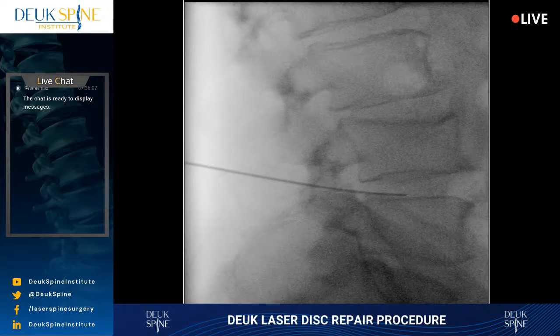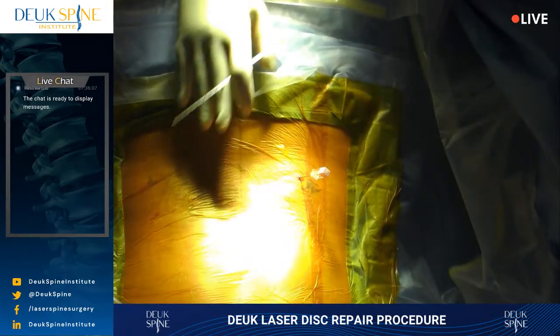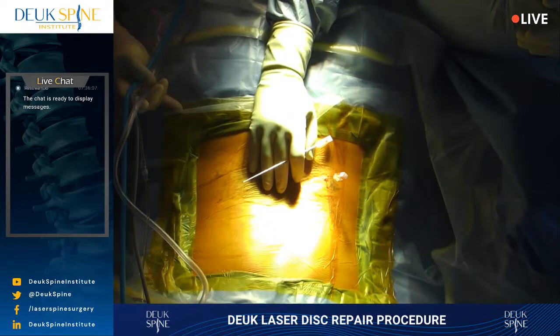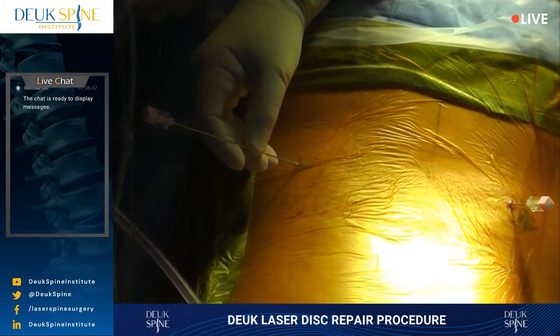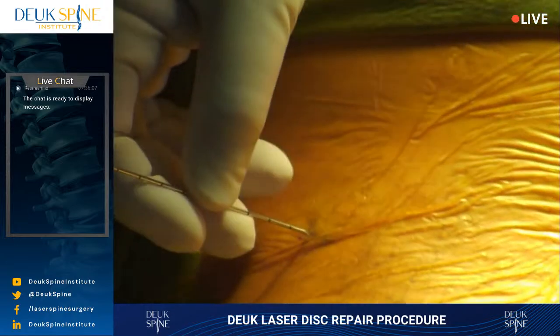All right. So we've accessed one disc. And the beauty of this procedure, unlike typical spine surgery where the surgeon makes the incision in the middle or just to the side, all those surgeries that other doctors do require damaging the muscles of the spine. There is no surgery that doesn't damage the muscles of the spine except for this surgery, the endoscopic transforaminal approach.